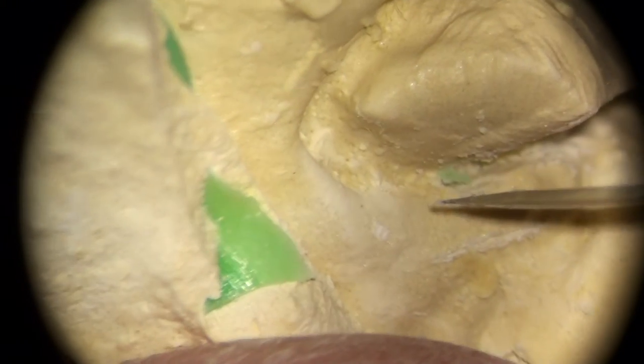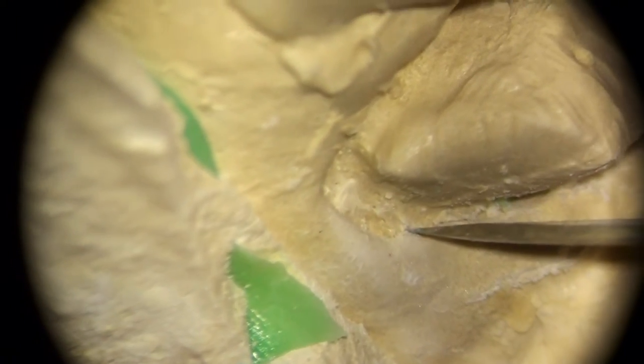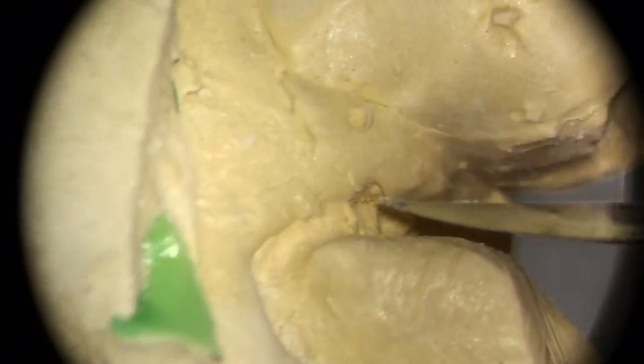But if we go down here and look for impression material that came off inside the stone, and sometimes we can hunt them from the outside in. And that kind of connects up with this almost invisible little line right there. Curve over here. And since it would be very difficult to make a prep like this, I'm going to assume that that's a big old bubble in the impression. So not quite a drag, more like a bubble. Again, probably moisture trapped in there.